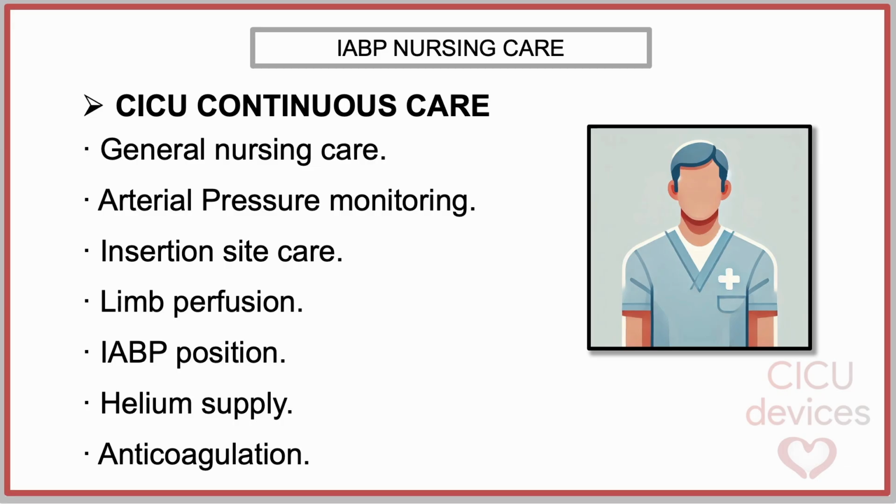During the maintenance phase of intra-aortic balloon pump support, nursing care plays a central role in ensuring both the effectiveness of the device and the overall safety of the patient. Continuous clinical monitoring and systematic bedside assessment are essential to detect early signs of complications and to maintain stable hemodynamic support. Nursing management during this phase typically focuses on close monitoring of vital signs, careful management of the vascular access site, safe patient mobilization within established limitations, and the prevention of common ICU-related complications.